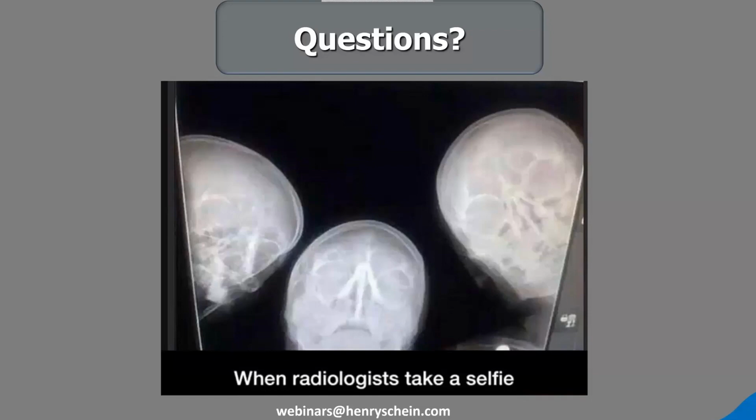And of course, we do see different schools of thought with what is out there. What is our legal and ethical requirement? Legally and ethically, every scan should be looked at. Every scan should be evaluated in entirety for pathology, whether that is done by the general dentist or by a radiologist, either way. A report is not a legal requirement, although if you find something you don't know what it is, certainly at that point, it would be prudent to go ahead and refer that on.